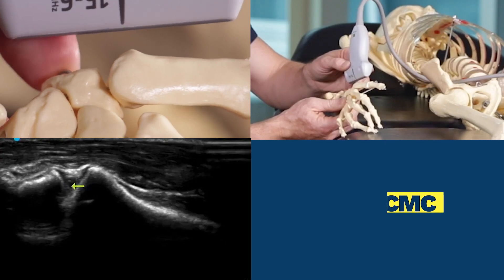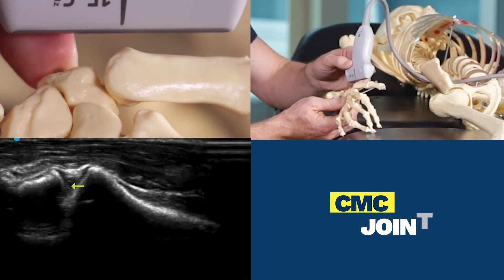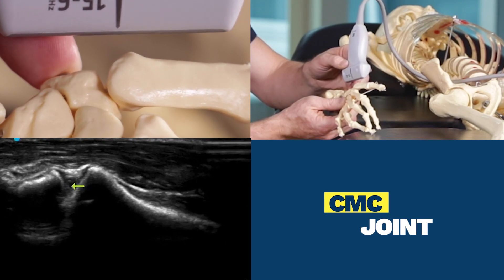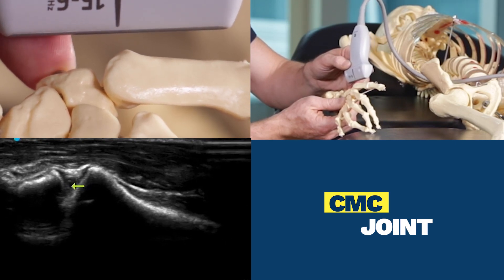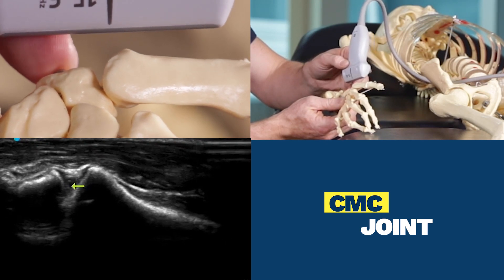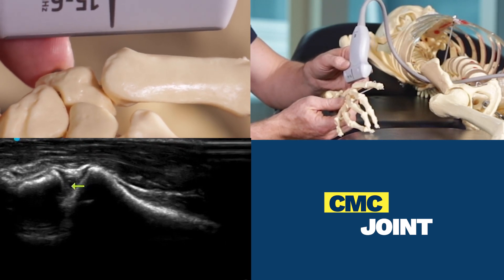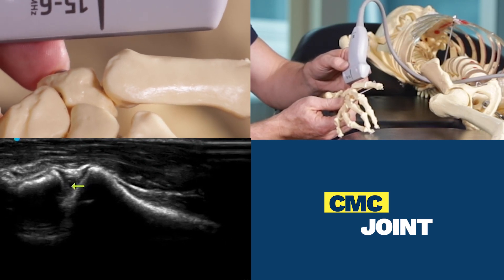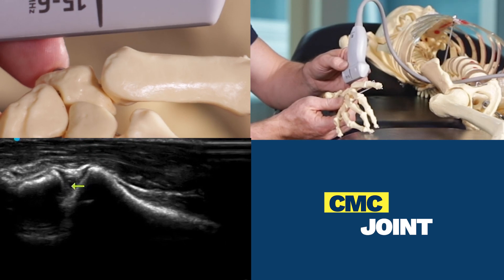The landmark is going to be along the shaft of that first metacarpal, and the movements are going to be very slight, gentle movements of the probe towards the palm or towards the dorsum of the hand, until we very clearly see the sharp metacarpal and carpal adjacent to it. The area of interest is where this metacarpal drops off — it's quite a steep angle.